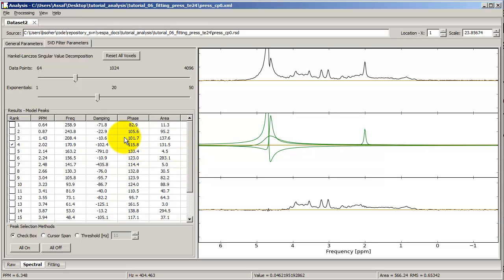So in a sense, the SVD algorithm is kind of a mini fitting algorithm. It's not a real fitting algorithm because it's a model-free one, and it doesn't really make the connection between the size of the peak and the amount of metabolite. For example, if you get a J-coupled peak that's split once, it's going to appear as 2 different peaks. And this SVD algorithm is going to try and fit them or display them as 2 individual components. But what you actually wanted from a fitting algorithm is for it to recognize them as 1 metabolite. So this is not really a certified fitting algorithm, but it's definitely an excellent tool for picking out particular peaks that you don't want and just filtering them out.